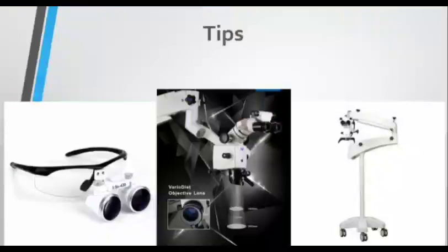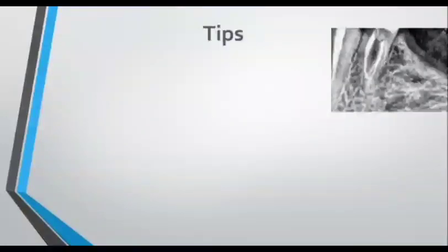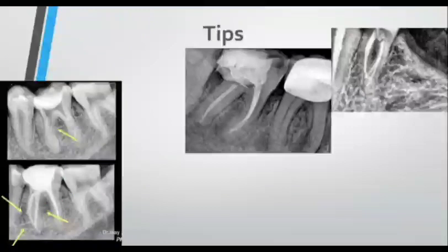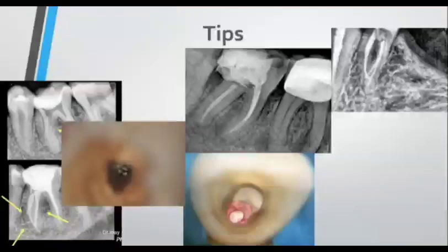Dental microscopes have led a revolution in dentistry. We are seeing more extra canals everywhere on social media. Many teeth that were doomed hopeless became full of hope thanks to the microscopes, which help increase the ability to remove broken files, return to the main course of the canal, bypass a ledge, or even seal difficult perforations and deal with complex anatomies.